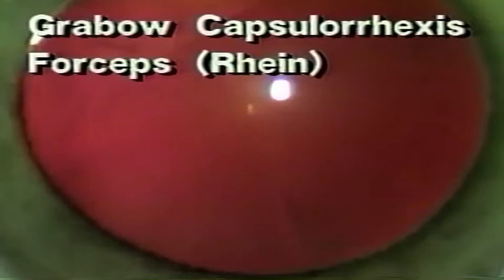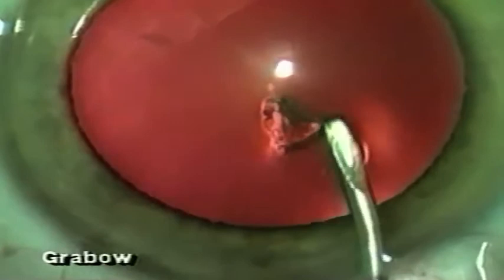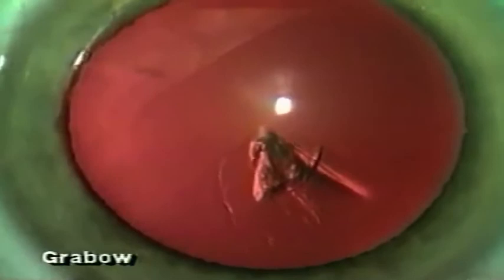It is August 1997 and I have recently had the privilege of developing a new capsulorrhexis forceps for my cases with Rhein Medical here in Florida. I begin the capsulorrhexis with a bent 25-gauge needle on the Healon syringe, making a starter radial incision in the capsule and turning it to the right in a counterclockwise direction.